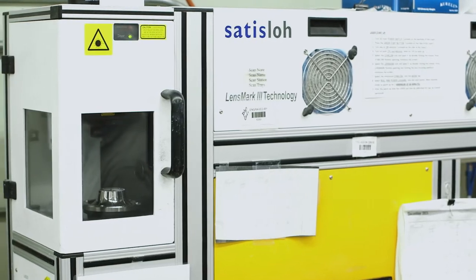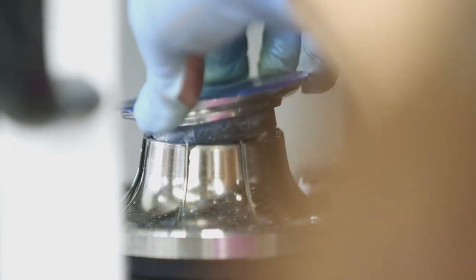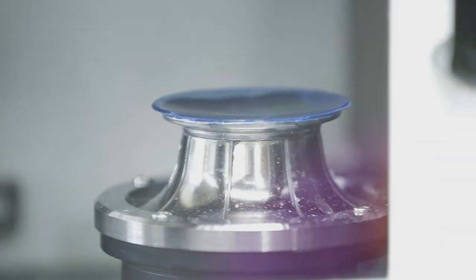For progressive lenses, there is an extra step in the process: the laser engraver. The markings applied by the laser engraver are like a thumbprint, uniquely identifying each lens design.